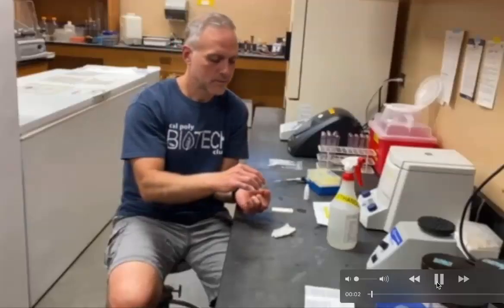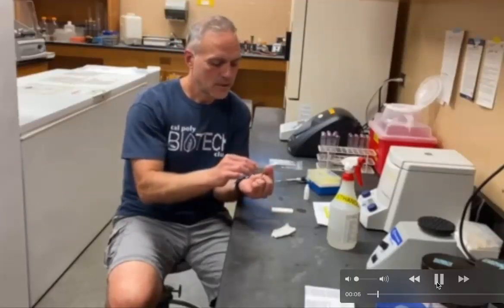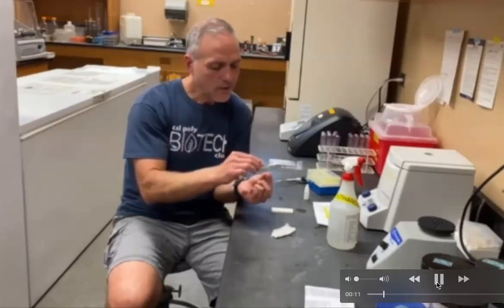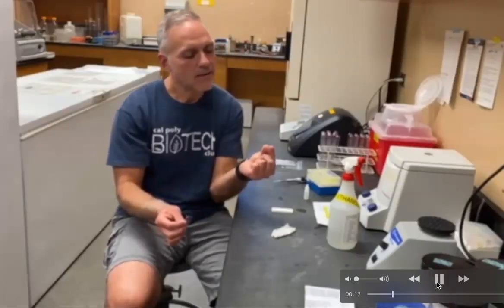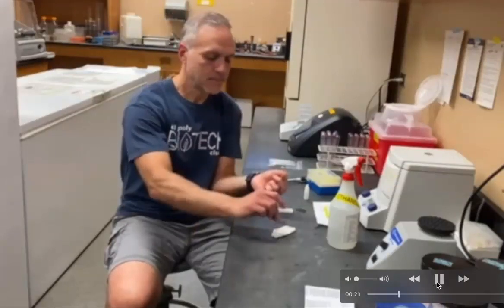So here I am using a sterile razor blade, not exactly the way to do this because I don't have a lancet, and I'm trying to slash myself to get some blood. Now I had to massage the finger a little bit to push the blood to the surface.